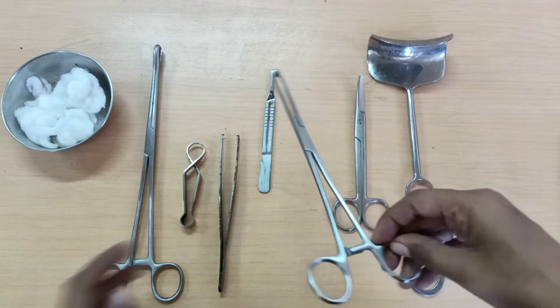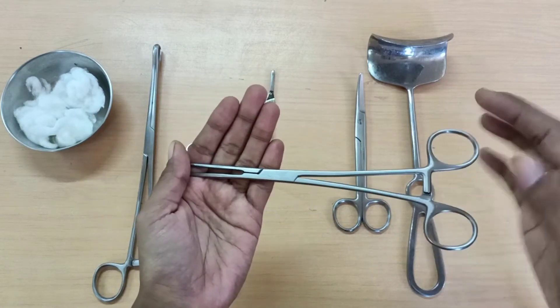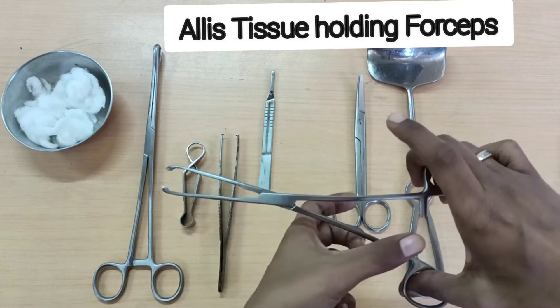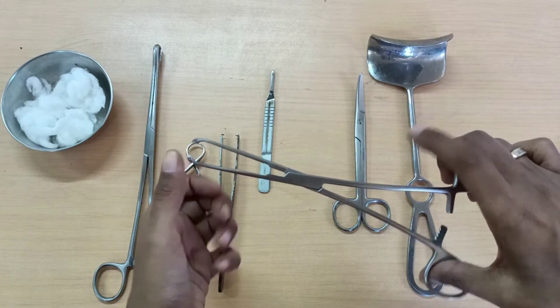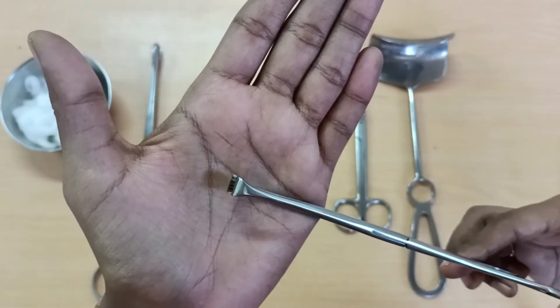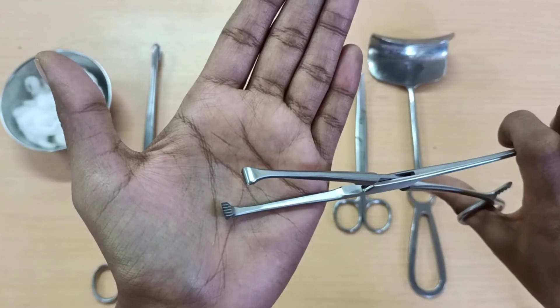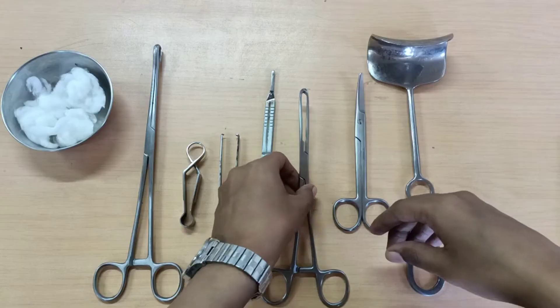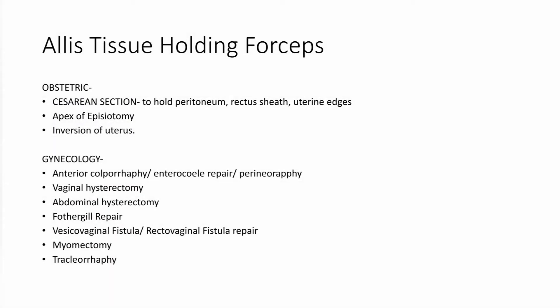When you come to the rectus sheath, you are going to require Alice tissue holding forceps. It has multiple rat teeth over its working end — you can see there are multiple teeth. It is used for holding tough tissue structures such as the rectus sheath. Other uses include: in caesarean section, holding the peritoneum, the uterine edges, or the apex of the episiotomy; inversion of uterus; and various gynaecological procedures.